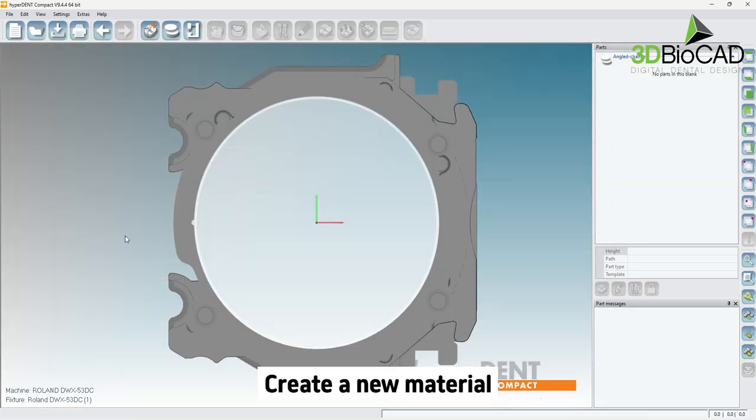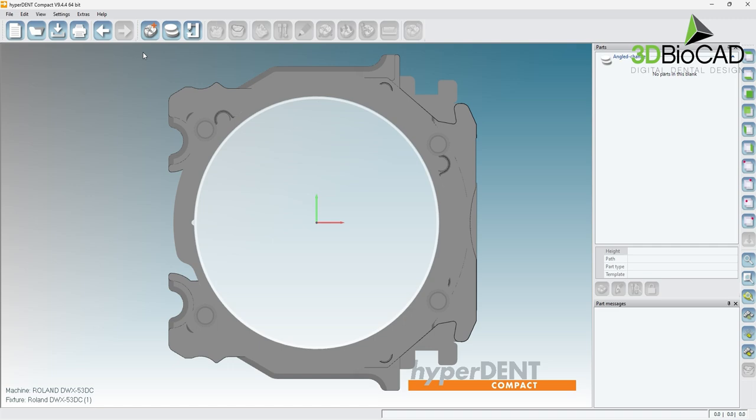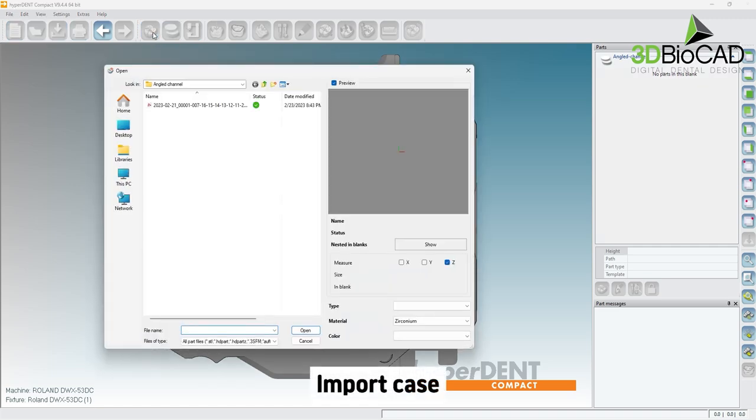Now let's import the design file by clicking on the load part option. Find and select the desired design file to import and click open.